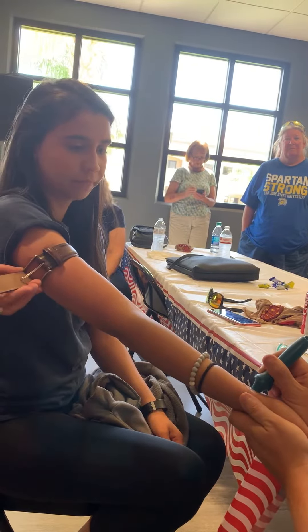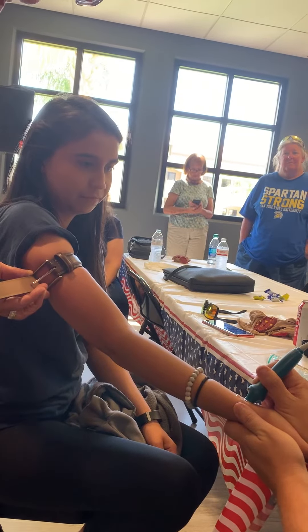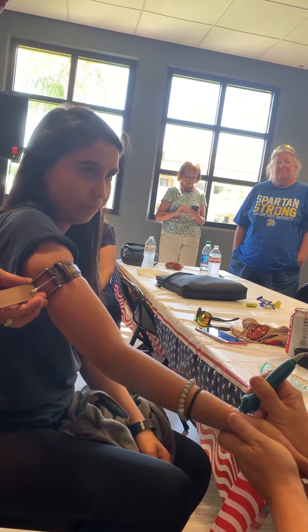We have a belt on and we can hear the pulse. With skinny arms, you would have to hold it like that — maintaining tension — for relief or until you're at the hospital.